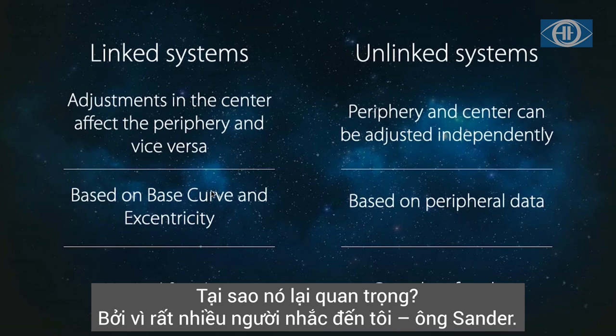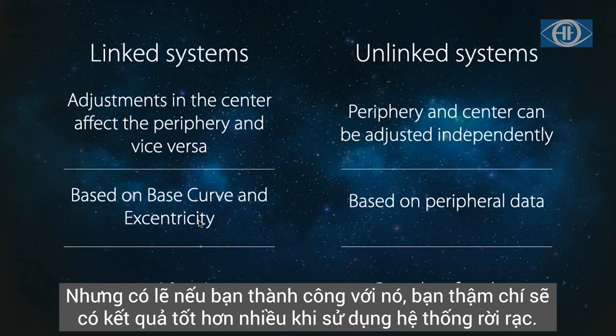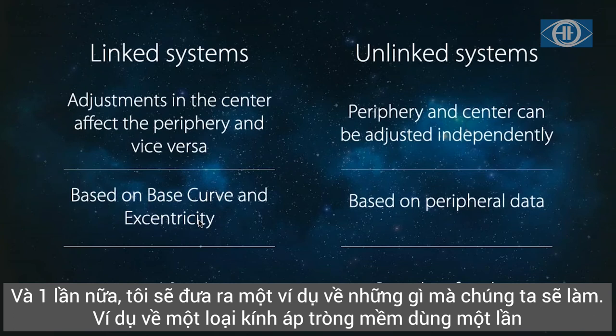Because a lot of people mentioned to me, but Sander, I'm quite successful with base curve lenses as well. If it is successful with base curve, probably you will have an even better result when you go to an unlinked system. So it is an add-on. It's the way we approach lenses in our practices. And well, again, let me give an example of what we do in the Netherlands, but probably overseas you will do it that way as well.